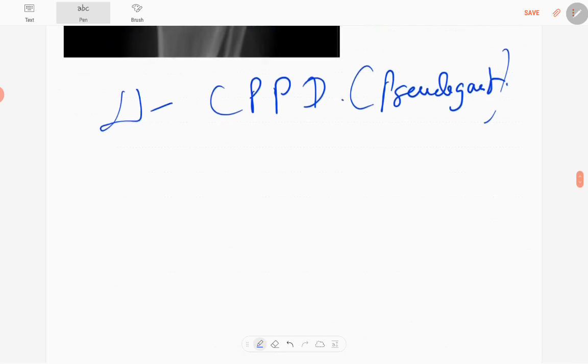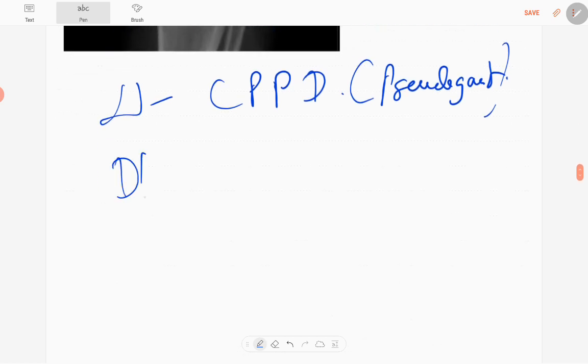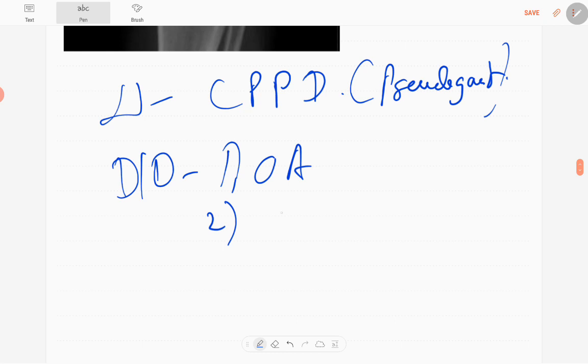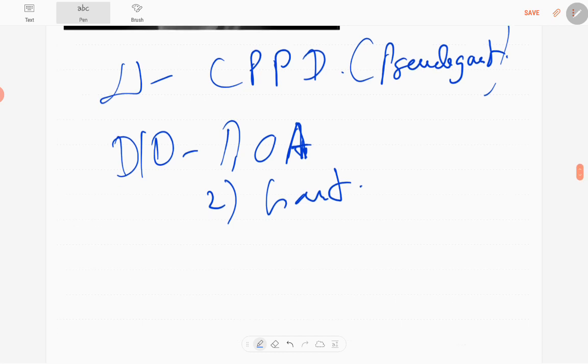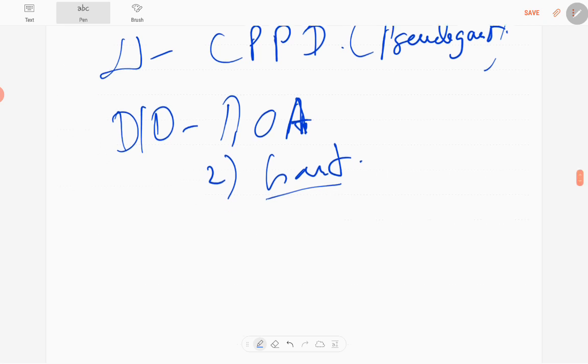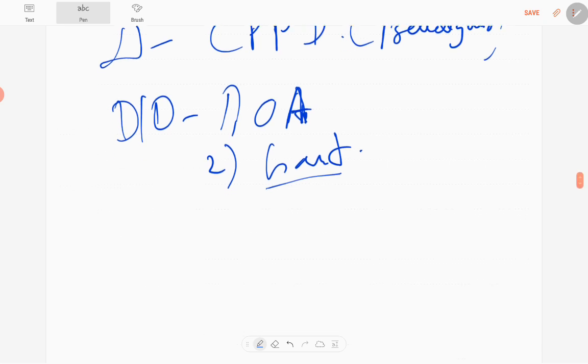Differential diagnoses are osteoarthritis and gout. In osteoarthritis, there is involvement of weight-bearing joints. In CPPD, there is involvement of non-weight-bearing joints. In gout, you can see some periarticular erosions and soft tissue swelling. CPPD is due to deposition of calcium pyrophosphate dihydrate crystals.